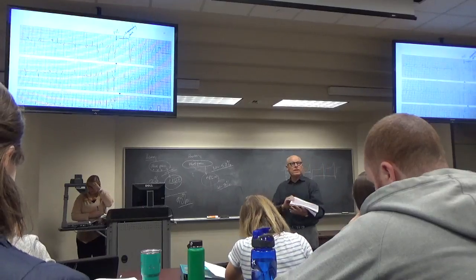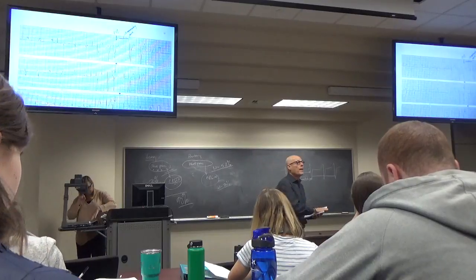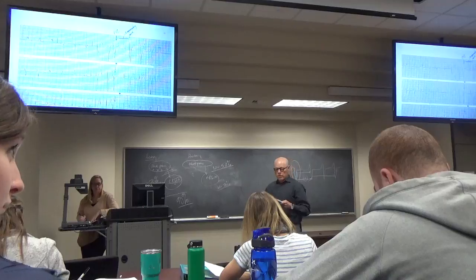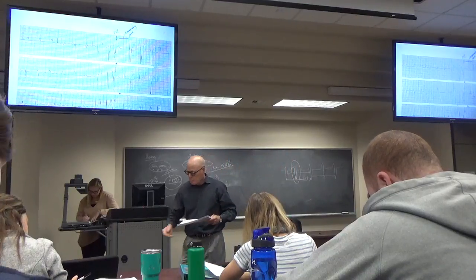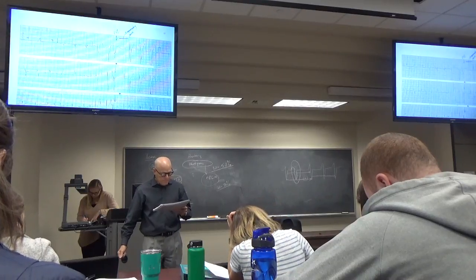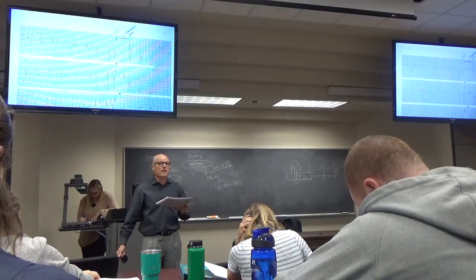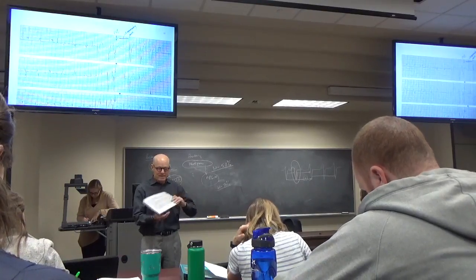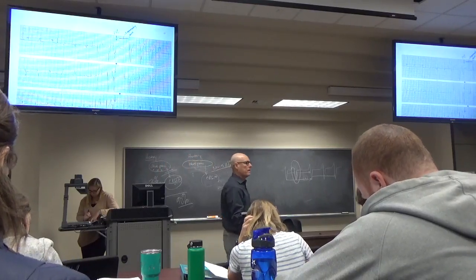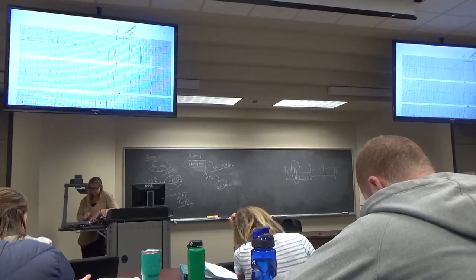Any other questions on 13? Can you go over that conclusion? Should I go over what? That conclusion. Who read this one? Would you go over the conclusions? Left bundle branch block, left atrial enlargement, first degree AV block, PVC. Left ventricular hypertrophy? I didn't write that, but it probably does have LVH. And the other thing this one probably has is the QT is probably too long. What did you say the QT was? 0.52.